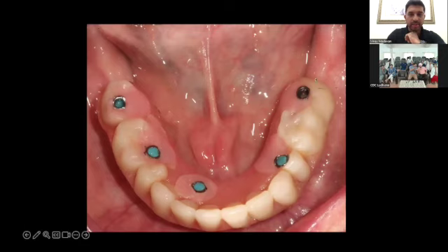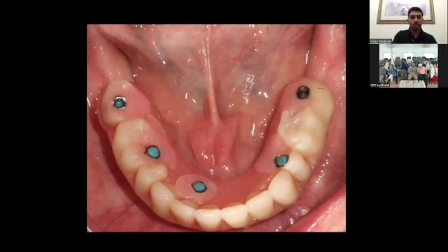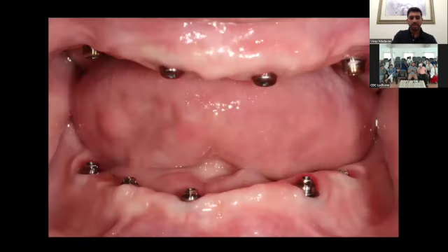Again, like I said, all these implants, as you can see, are coming in the right location where you want them to be. They're not too facial. They're not coming out of buccal surfaces. So this is how you want to plan and make sure that your treatment is actually completed in a similar fashion that you want it to be. That way you can avoid a lot of complications. And from here onwards, it's a very simple case, correct? So this is how the tissues look.